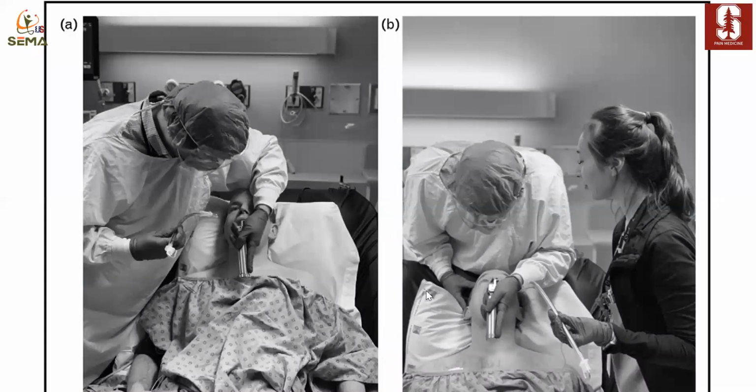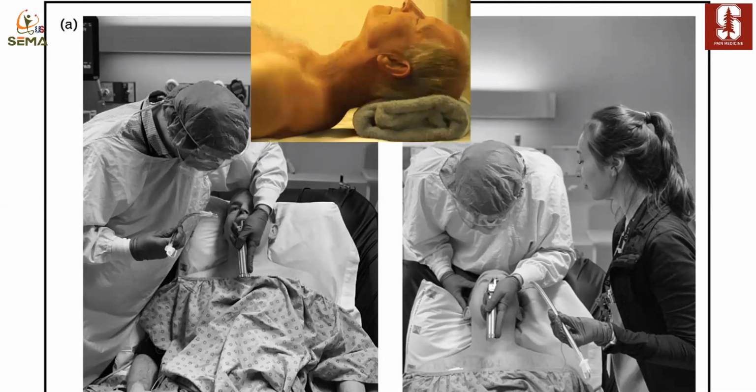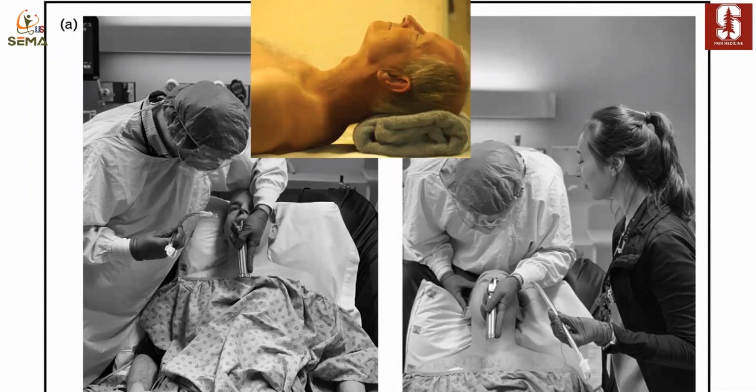Now positioning: ideally I like this position where I come from the head of the bed. Make sure you have your assistant having the tube ready to go. You have the suction, everything. We'll go over the checklist now. But position the patient in a position that makes you comfortable. I mean, if you enter the room and they're doing CPR, that's a different story. But position is very important. And remember, at the end of the day, sniffing position is your friend.